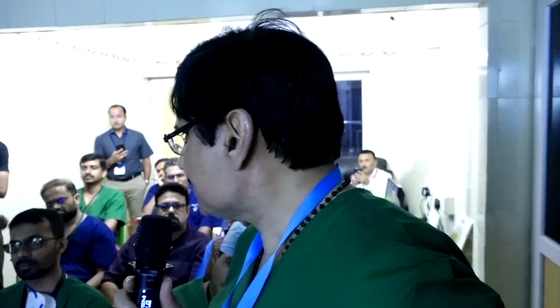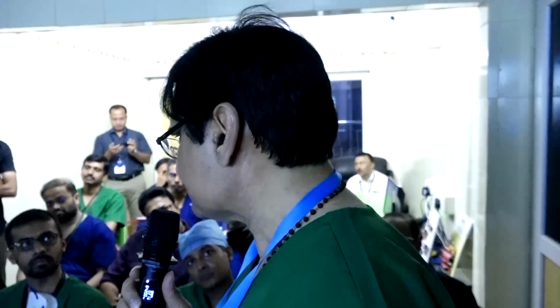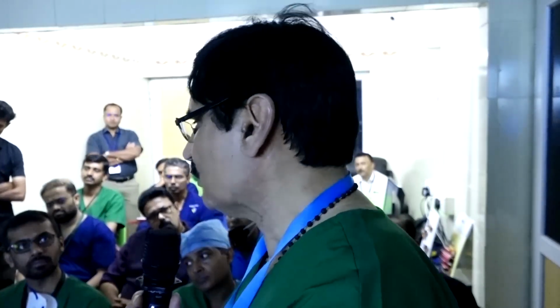So first of all, the most challenging cases, as everybody knows, are calcium, and the imaging ultimately will be very useful, crossable or uncrossable. If the imaging catheter is crossable, then you can do the OCT image or intravascular imaging and see the patterns of the calcium, 360 degrees, and wall calcium also more than 0.5 millimeters. The quantification is important, so that you should do with more aggressive atherectomy devices. Once it is fluoroscopically tram track, definitely the score will be more than 4, actually the Fujino scoring system by OCT. So naturally the atherectomy device you have to use and debulk the calcium.